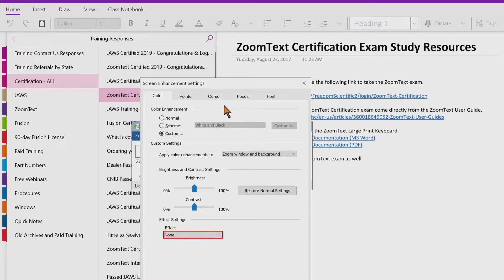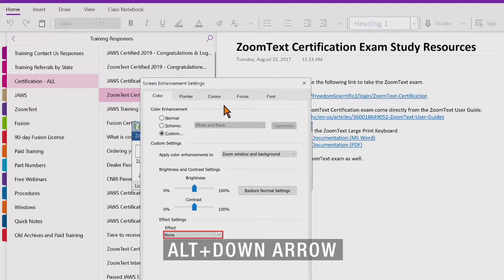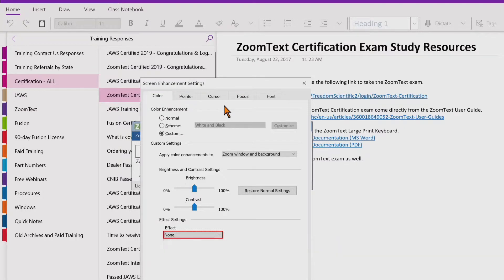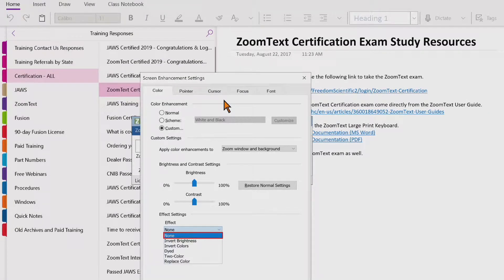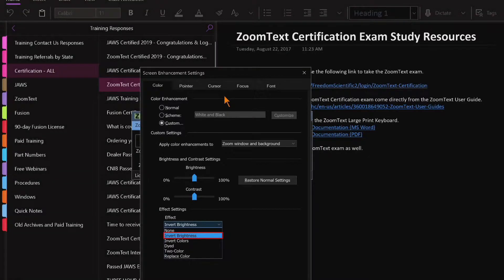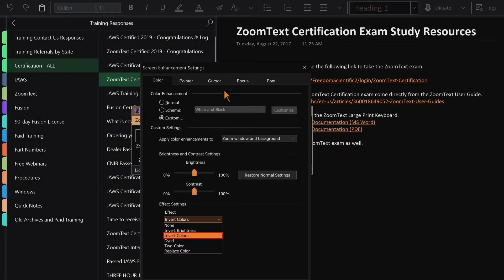Here's the effect combo box. I'll press Alt Down Arrow to open up a list of choices. The first option is None. Moving down: Invert Brightness, which actually inverts the brightness of all screen colors — light colors become dark and dark colors become lighter. Next is Invert Colors, which inverts all colors on the screen.